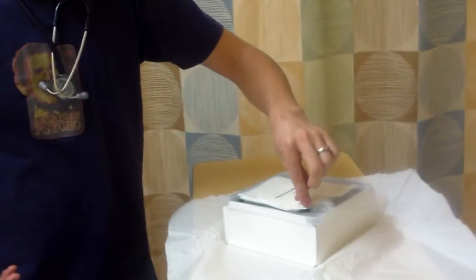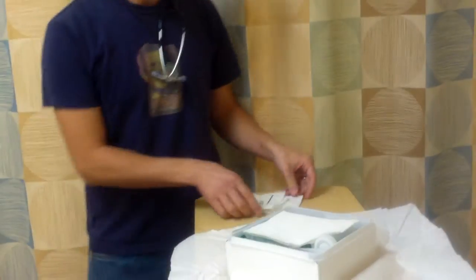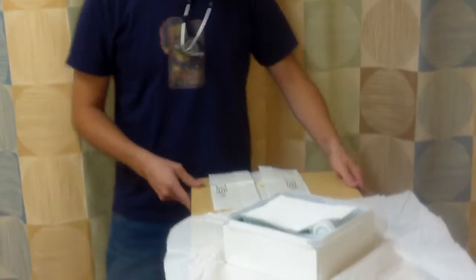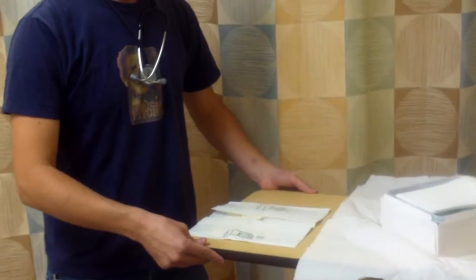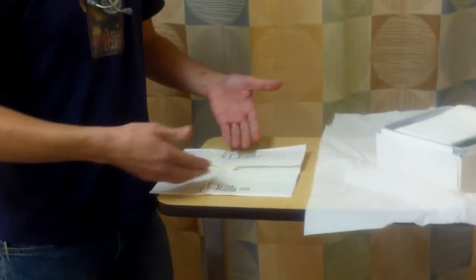So the next thing I'm going to do is take my gloves out. Alright, and then I'm going to put on my gloves. So I'm just going to stand here on the side. Right here. You can use that size? Yeah, I can use the size. I'm actually going to rotate my table a little bit so you can better see this. I'll just have to manipulate this with my foot thereafter so you can see my sterile technique.